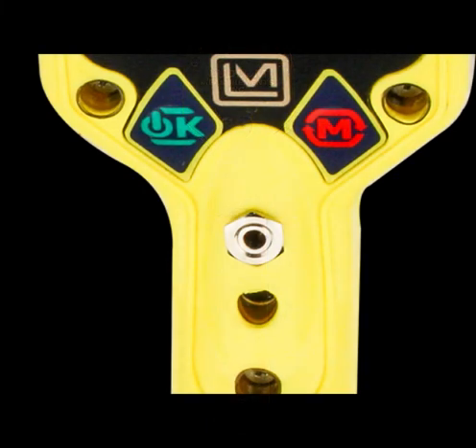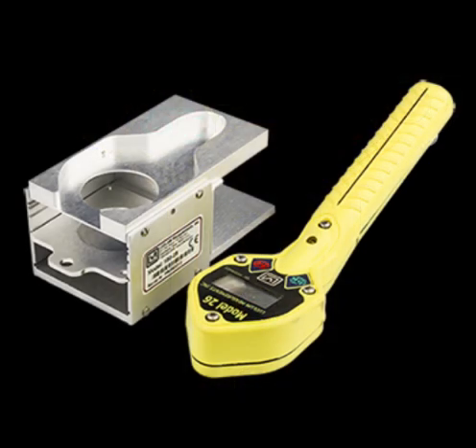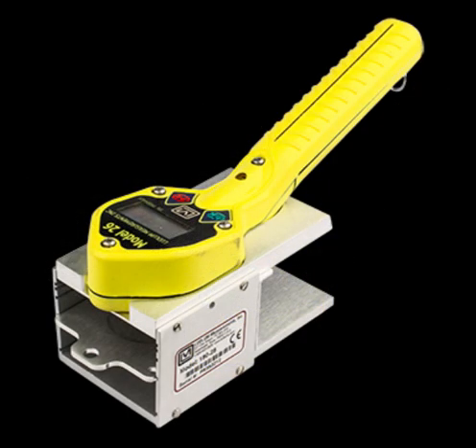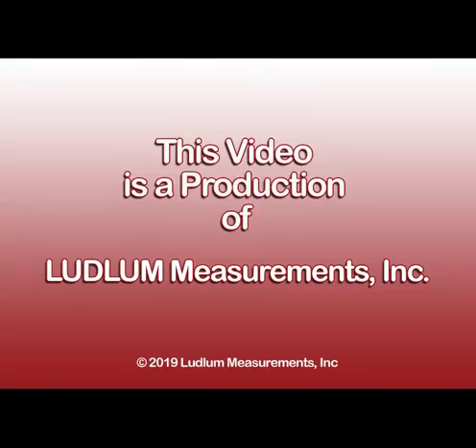Another option adds a headphone jack to the instrument body so headphones can be used to monitor the audio and audio alarms. Headphones are also helpful when the instrument is used in areas with high ambient noise levels or where the audio might be distracting to others, such as medical or office environments. Ludlum Measurements also offers the Model 180-28 sample holder, which allows for repeatable geometry counting of wipes, filter paper, or slides. For more information, visit our website or contact Ludlum directly or through your sales representative.